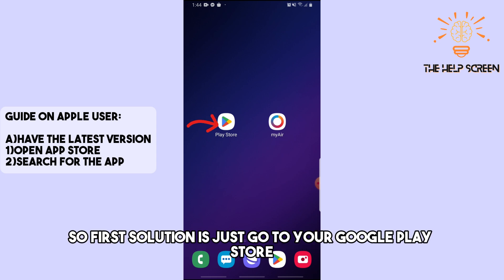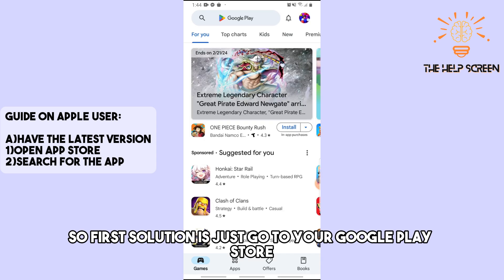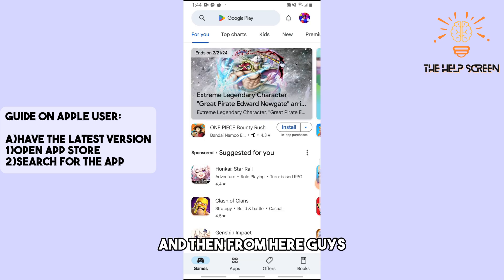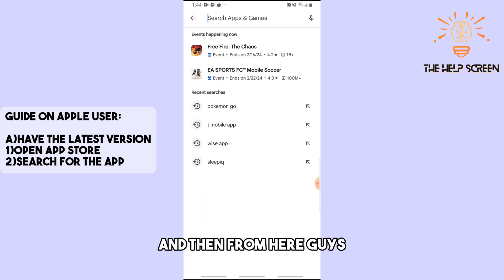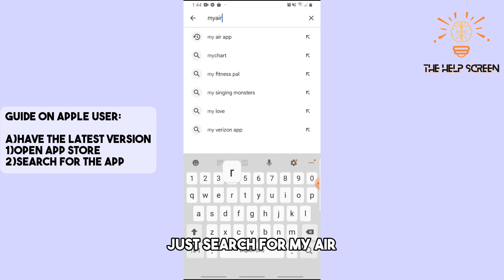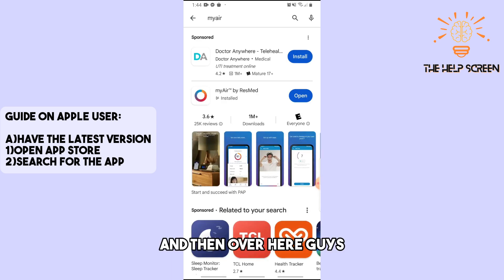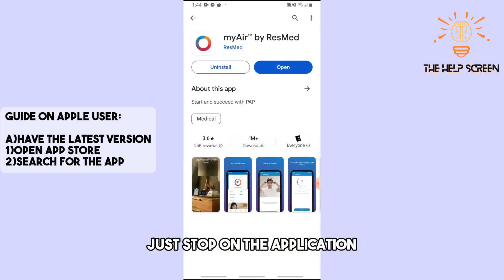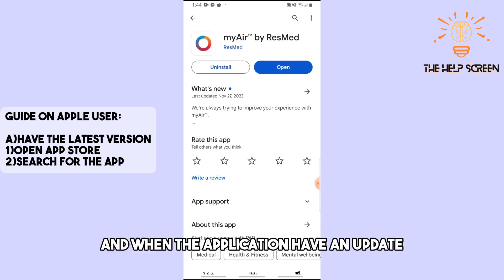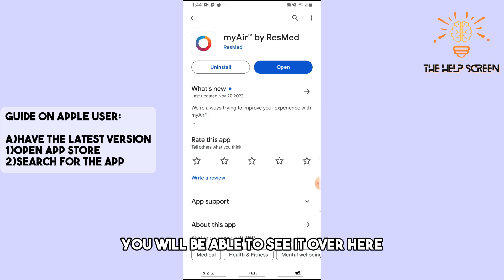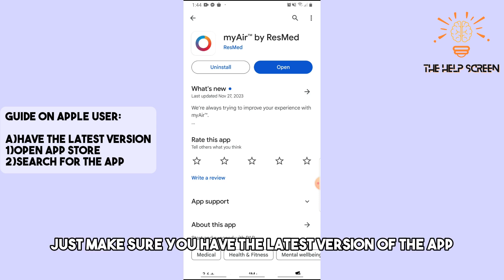The first solution is to go to your Google Play Store and search for MyAir. Tap on the application, and if the application has an update you will be able to see it. Make sure you have the latest version of the app.